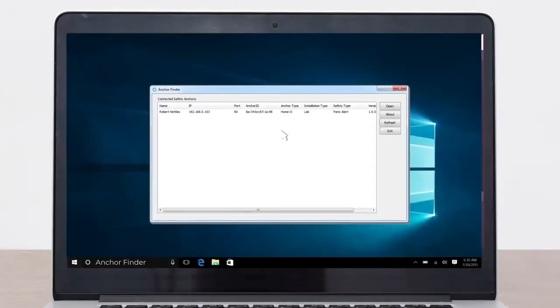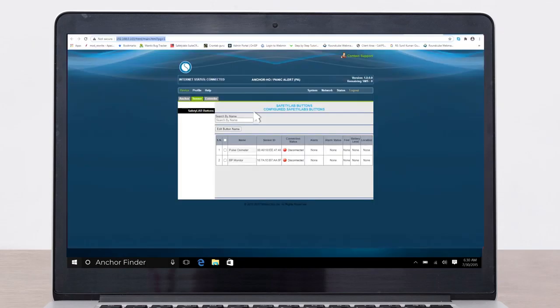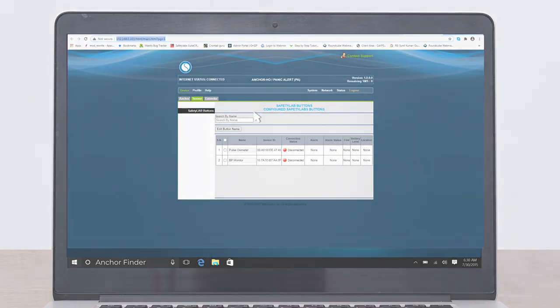Start the anchor finder. Now the cloned anchor will show on the anchor finder with the existing patient's name. Double click on the anchor to start the browser and confirm the anchor is set up properly.